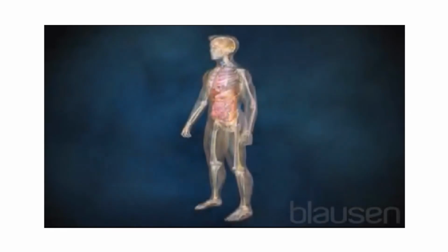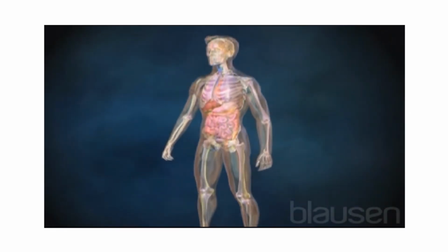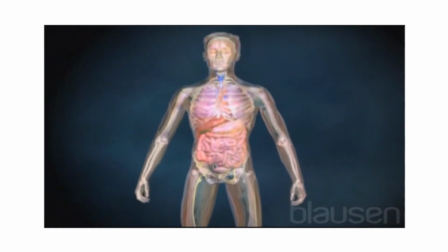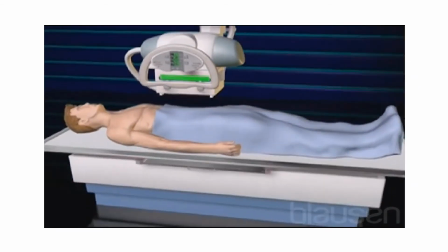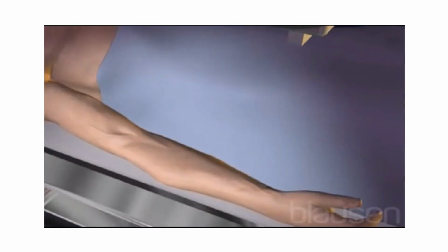Let's explore how X-rays and CT scanners work. A CAT scan is used to detect both bone and soft tissue damage. During the procedure, three-dimensional anatomical imagery is created by utilizing X-ray technology. X-rays are used to create images by shining a high-energy electromagnetic beam through the patient's body.